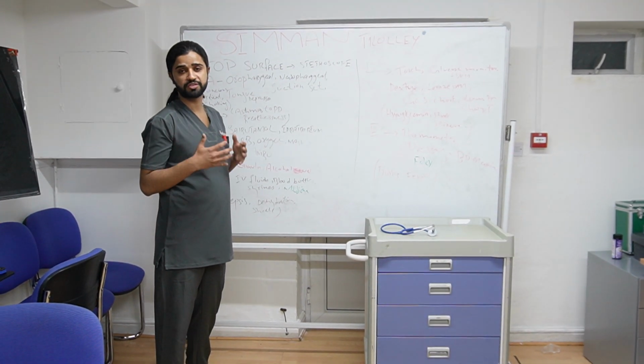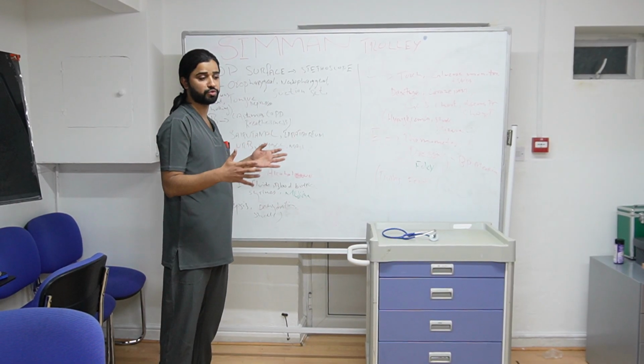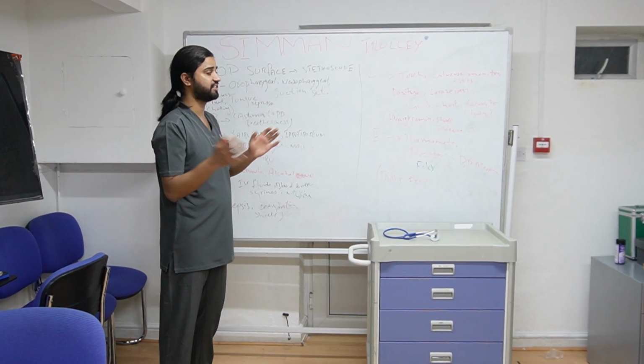Hello everyone, this is Dr. Mohsin and today I'm going to discuss how to find the relevant things in SimMan Trolley. This is one of the most common confusions candidates have in the exam.